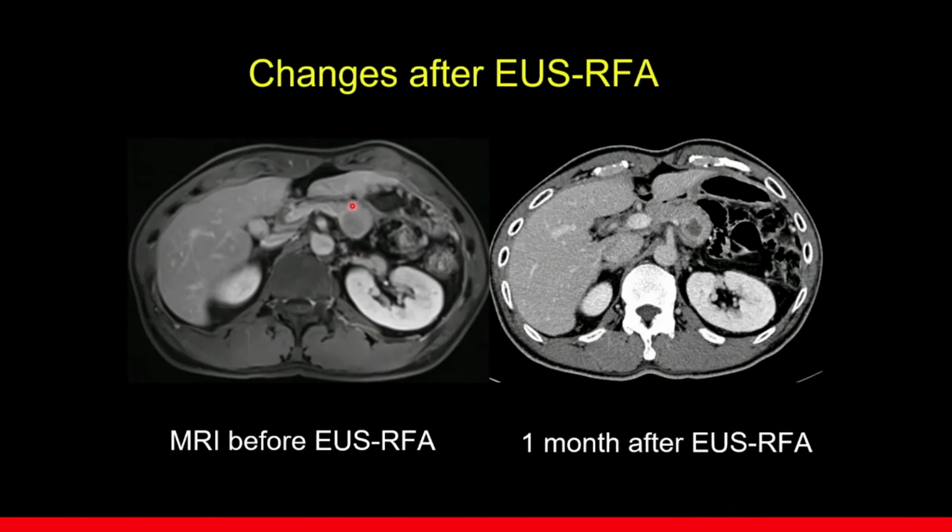Left side is before treatment and the right side is 1 month after treatment. We can see necrotic area in the tumor.